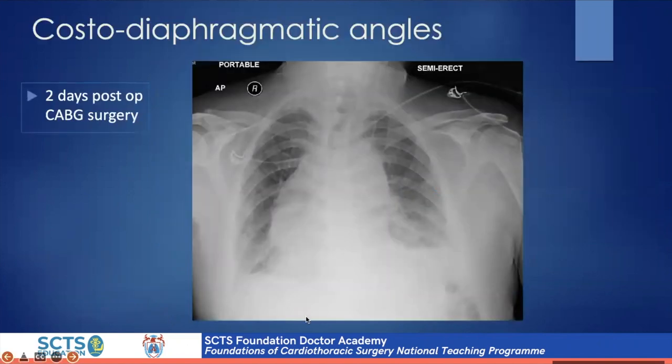And looking at now the costodiaphragmatic angles. So again, if someone could comment, maybe someone else, but apart from Calvin, you've done really well. You've got a patient which is 2 days post-op following a coronary artery bypass surgery. What do you think of this chest x-ray?